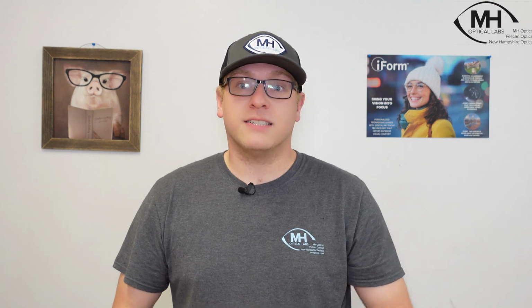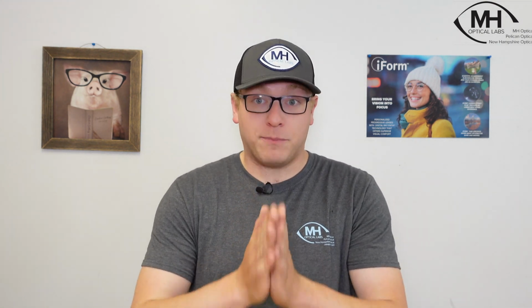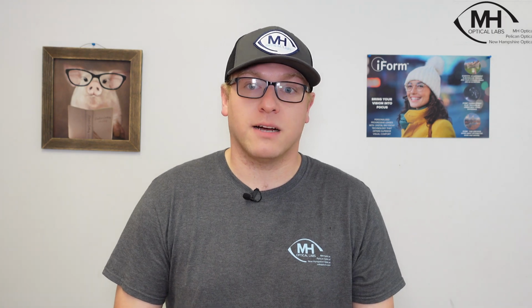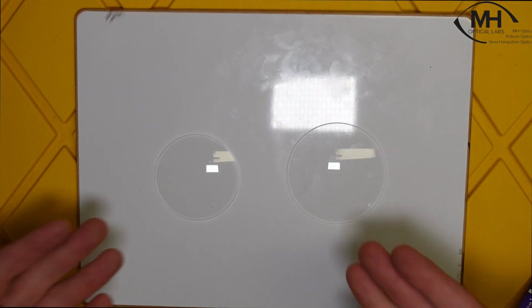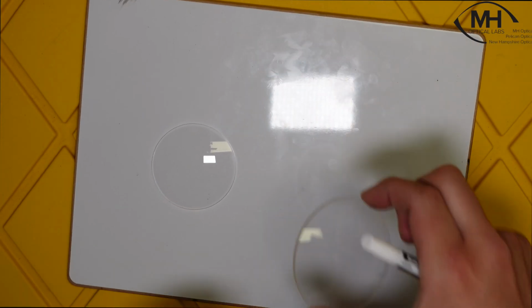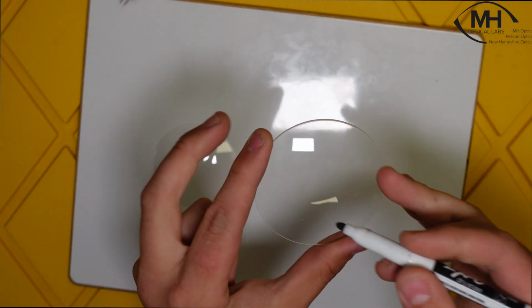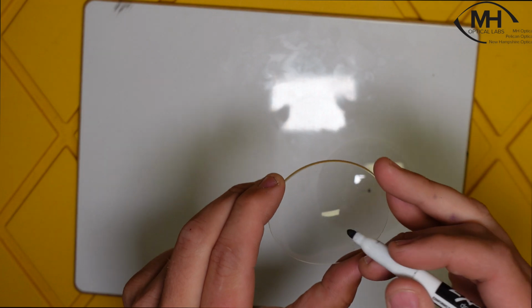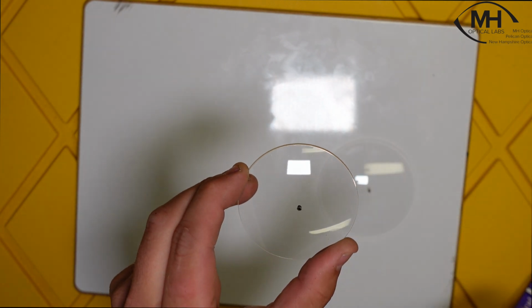With a stock lens, it's something we can pull off the shelf, the OC's in the center, and the optician or the person cutting the lens has to be able to decentrate it, and that's where the minimum blank size comes into play. Here are two stock lenses, 75 and 65. Where is the OC on this? It's going to be right in the center of the lens. Same with this, right in the center of the lens.